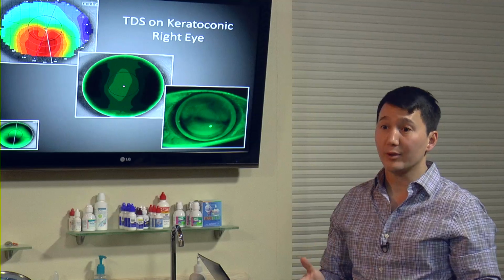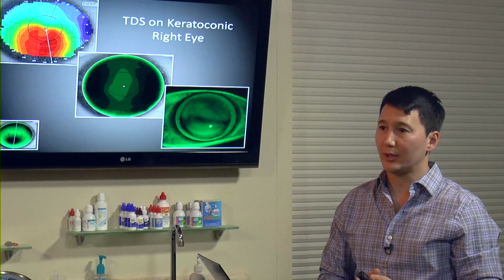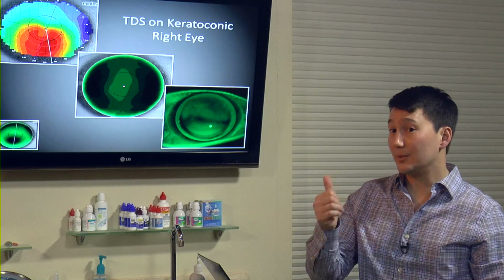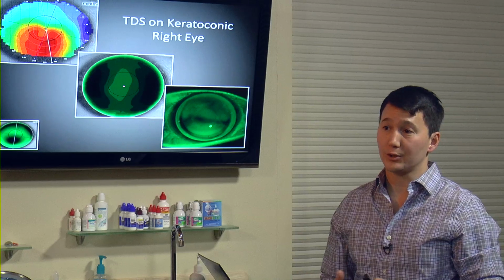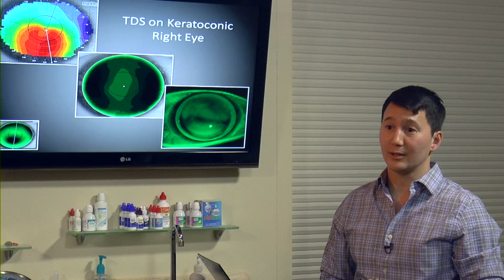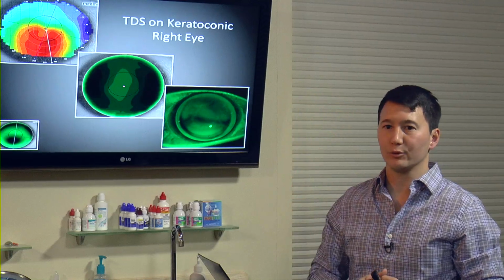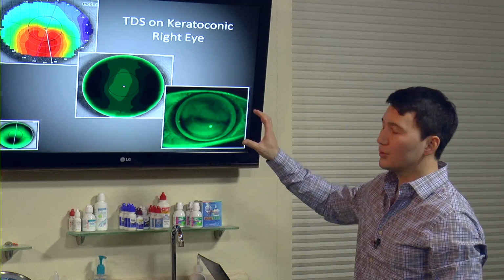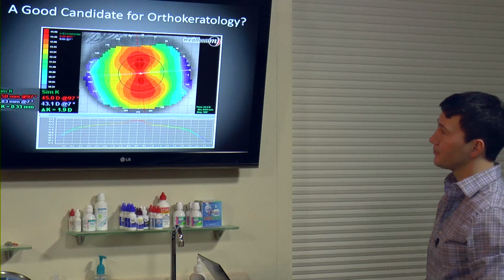We know that not every patient can wear a scleral. We're as hot on scleral as everybody else is, and as the team at Valley is in terms of scleral. But we know the deep set eye is tougher to get those lenses in. We know a certain percentage of patients have persistent fogging, that within minutes of putting the lens on, they just fog right up. That fluid layer just gets fogged up. So they can't wear a scleral lens. So this is where we think this might fit in. So excited about this future.